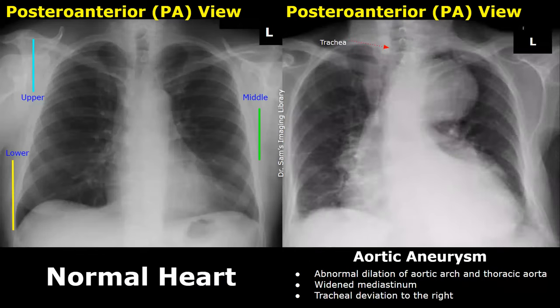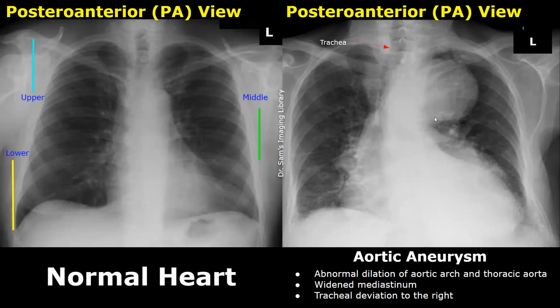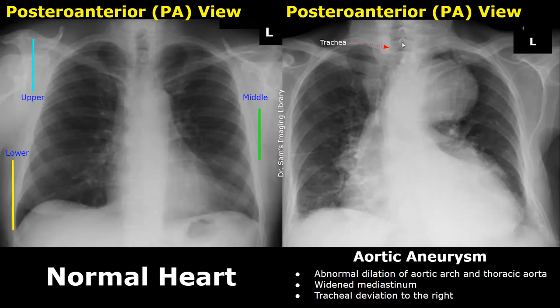Aortic aneurysm refers to abnormal dilatation of the aorta, detectable on X-ray. In this case there is abnormal dilatation of the aortic arch and thoracic aorta. Another feature usually seen is a widened mediastinum. In severe cases the trachea may be deviated to the right side due to the enlarged aorta — in a normal image the trachea is midline, but here it is displaced to the right.